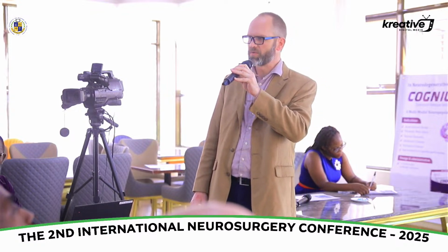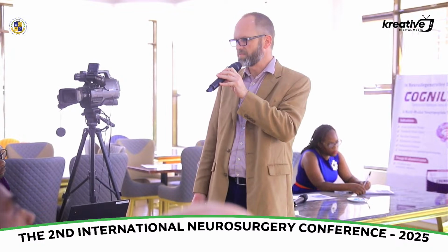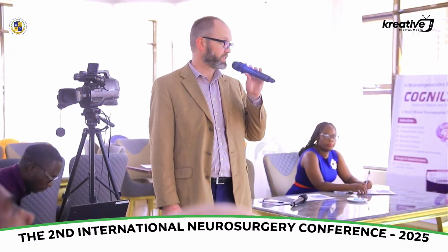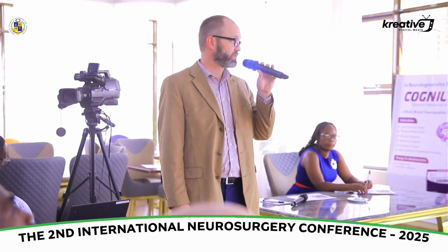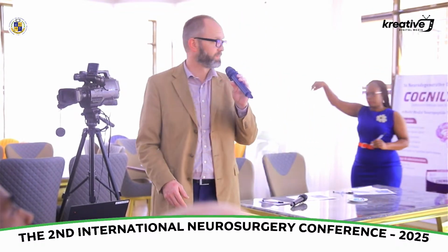B-mode ultrasound, as it was developed, is really what led to a lot more utility in other realms of medicine, including neurosurgery. It's called brightness modulation, and this is a two-dimensional image of the underlying tissue. And again, the brighter the image, the denser the tissue.